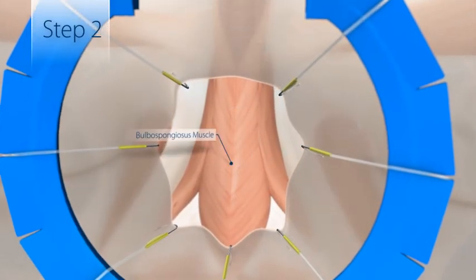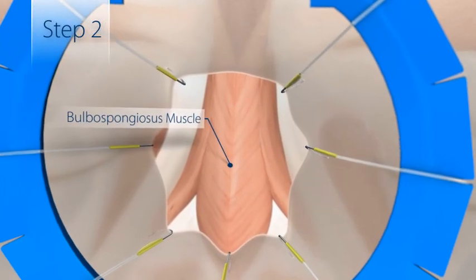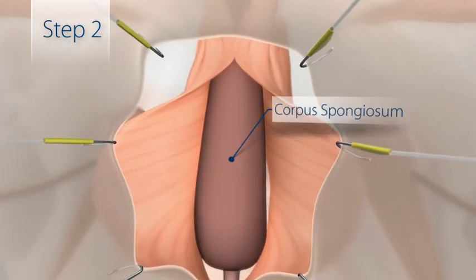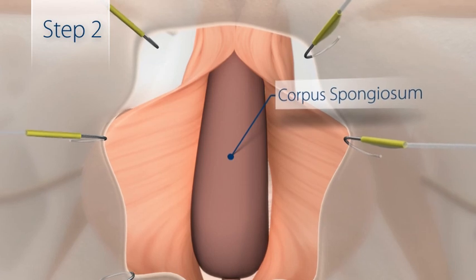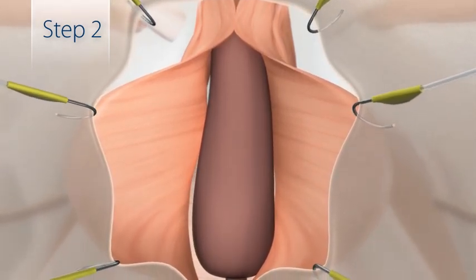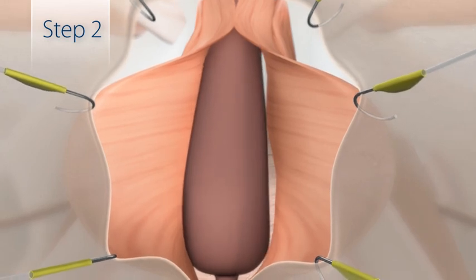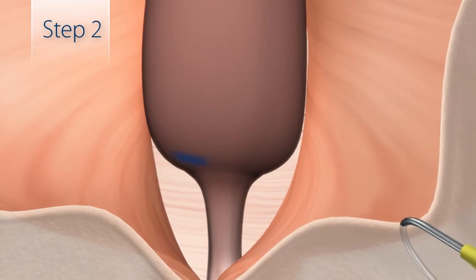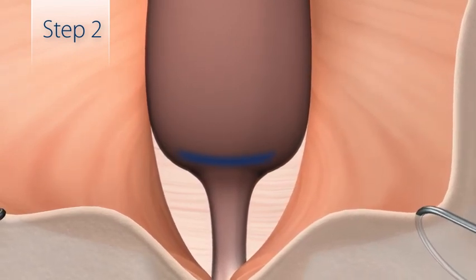Next, the bulbospongiosus muscle is opened along the midline and reflected laterally to expose the corpus spongiosum. To allow mobilization of the bulb, dissect laterally between the muscle and the corpus spongiosum. Identify the central tendon by lifting the proximal bulb anteriorly. Mark the origin of the central tendon on the bulb.